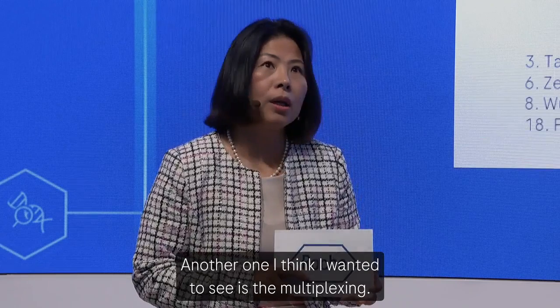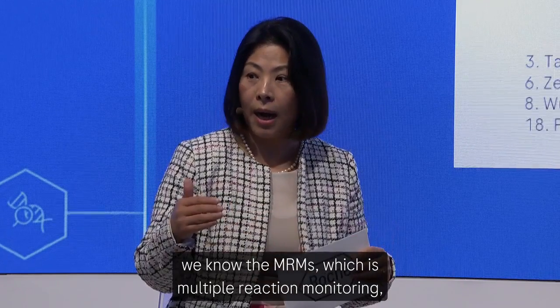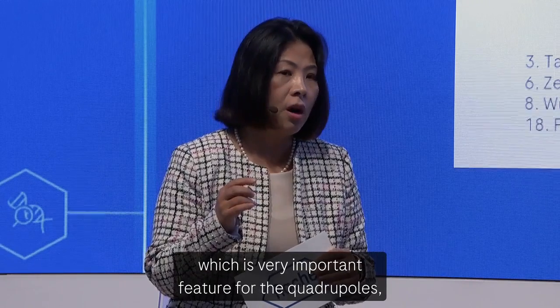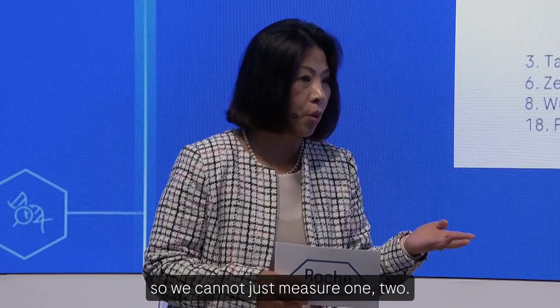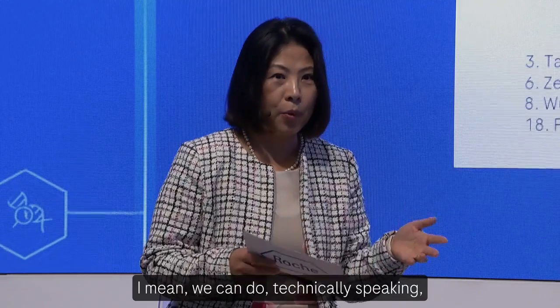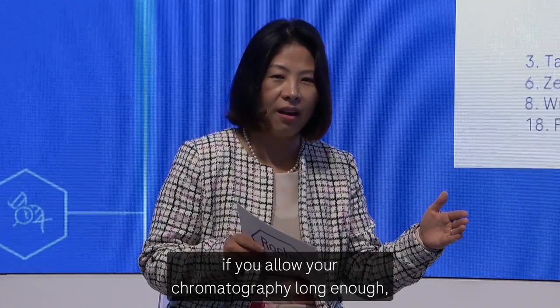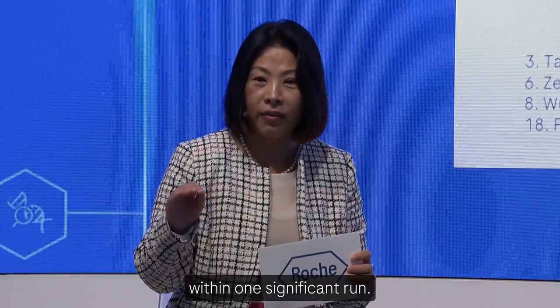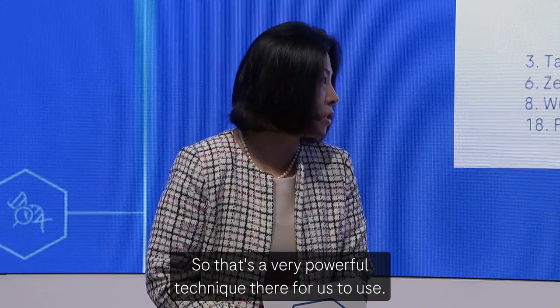Another one I wanted to mention is multiplexing. With the mass spec, we know the MRMs, which is multiple reaction monitoring, which is a very important feature for the quadrupoles. So we can measure not just one or two. Many assays have 10, at least in my own lab, like 20. Technically speaking, if you allow your chromatography long enough, you could go to hundreds of compounds within one single run. So that's a very powerful technique for us to use.